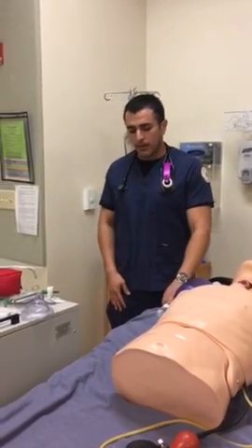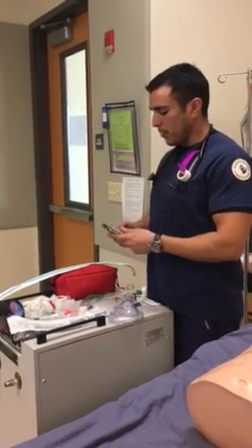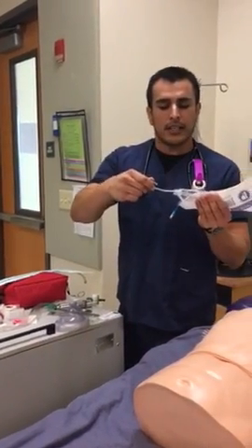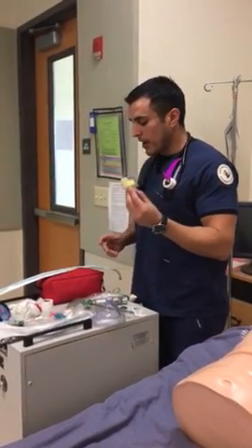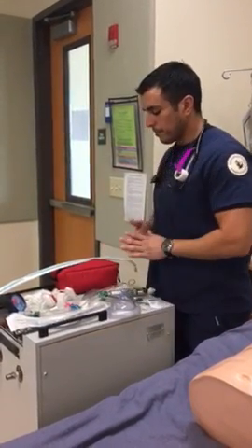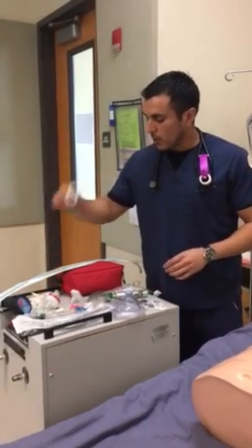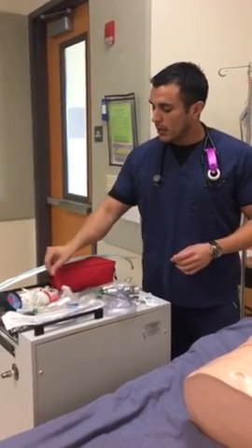Next we would gather our equipment. We would be grabbing our blade and our handle. We would be grabbing our tube and stylet. The stylet is already in, so that's going to give us some leverage to put the tube in. We would be grabbing a capnograph, so that's going to let us know if we're in the airway. We're going to be grabbing a syringe to fill the cuff. We're going to have a securing device, so we could use a tie or we could use tape. We're going to need a bite block also.